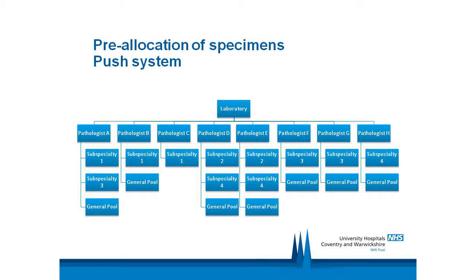Regardless of the efficiencies you can get from just not having to find a physical slide, I think the more important aspect about the return on investment as far as digital pathology is concerned governs how you control the workflow to your pathologists, who are usually the most expensive part of the department.